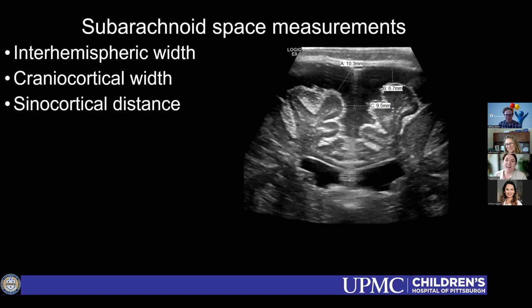And so where I came down on it, I basically said, measure how you want to measure. And then if we're doing follow-ups, make sure you're measuring the same way you measured the first time, so you at least have some internal consistency. I am of the craniocortical distance, a straight up and down measurer person myself. But I can understand that there are challenges with all of them.